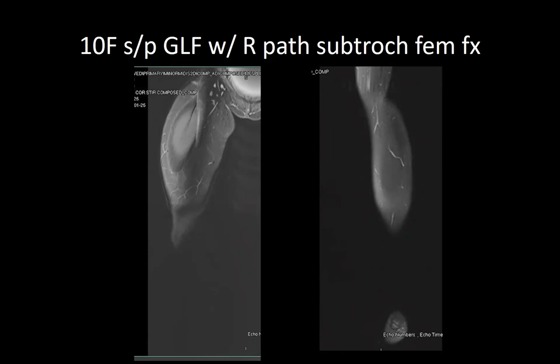I think this is also one where you could consider a rigid lateral troch nail if she were big enough for the 7 millimeter OrthoPediatrics lateral troch nail. That might actually be a good indication in this case, just to span all of those lesions.